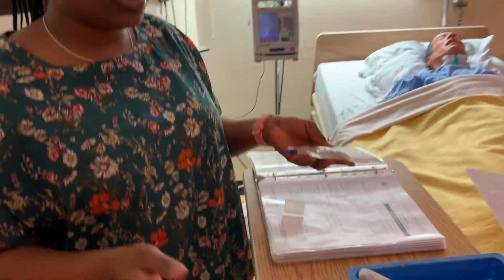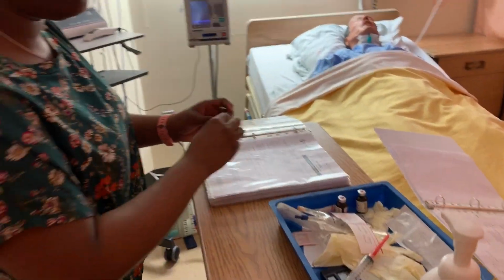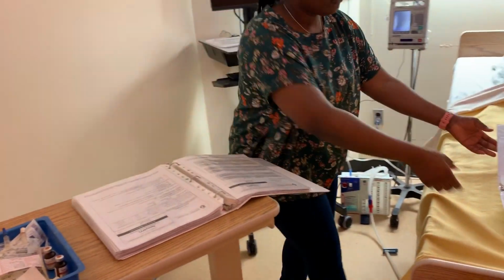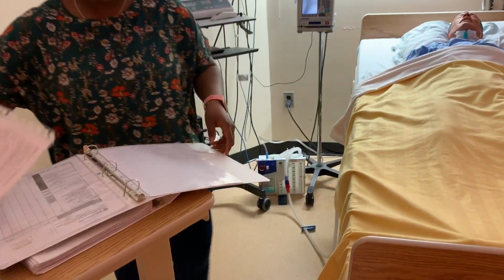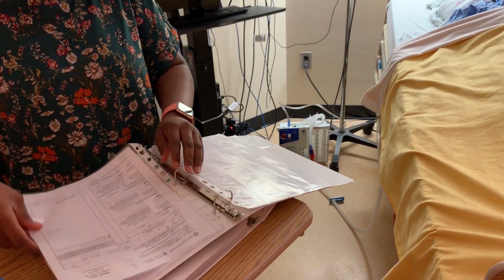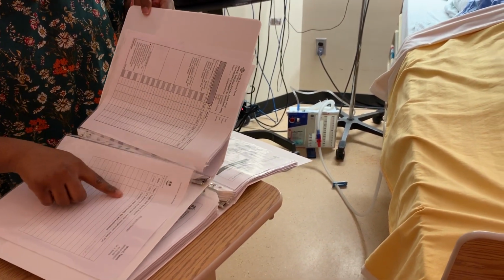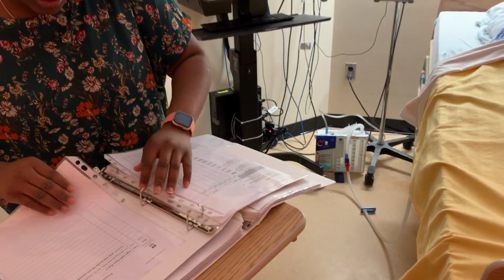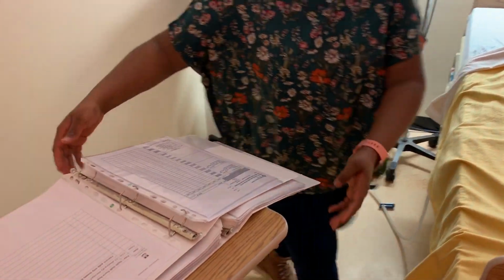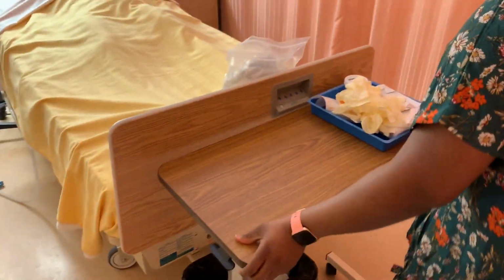So my nurse is going to administer this medication. So again, I have to do a chest tube dressing on my patient. So I'm just going to take this off. Take this, so I'm just going to take it out. It also said I have to do a chest tube dressing on my patient today. So I'm just going to drop this aside. So now I'm gonna move to my patient's room.